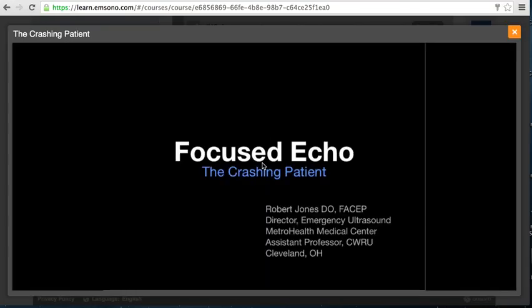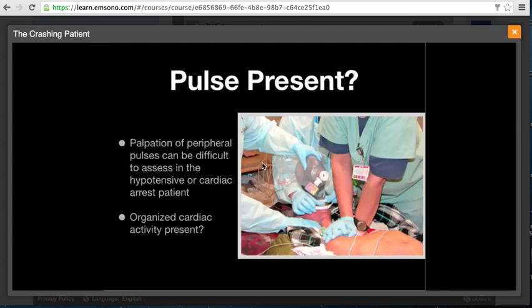I'm Dr. Robert Jones, and in this lecture we're going to review how to use focused echo in the crashing patient. How many times have you been involved in a patient who's crashing, or the cardiac arrest patient, and there's significant question as to whether or not the patient has a pulse or not? Remember, palpation of peripheral pulses or even central pulses can be difficult to assess in the profoundly hypotensive or cardiac arrest patient. And what you really need to know is, does the patient have organized cardiac activity present? And this is something that focused echo can be very helpful in determining.